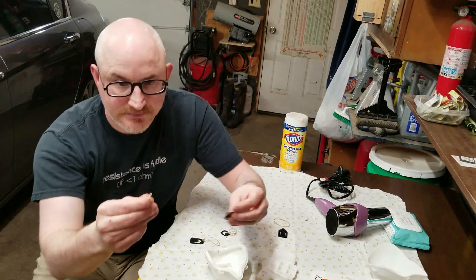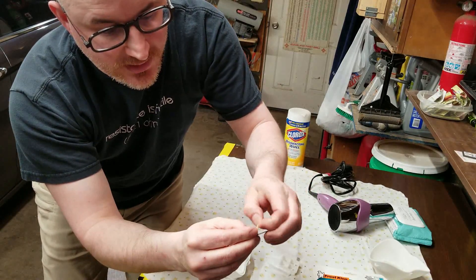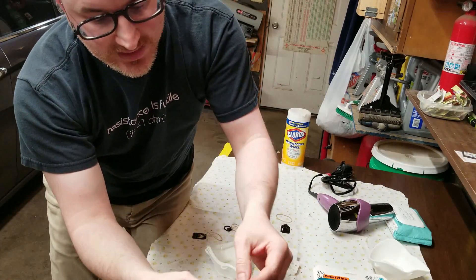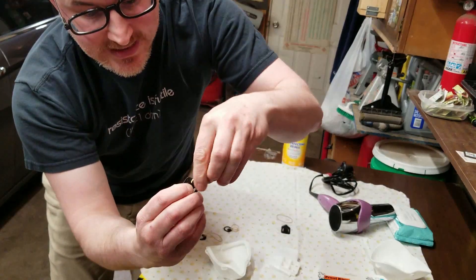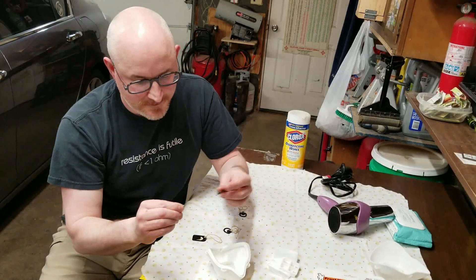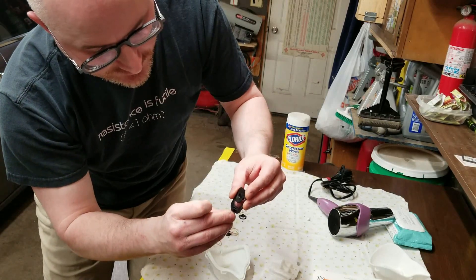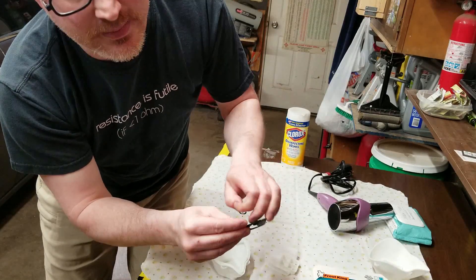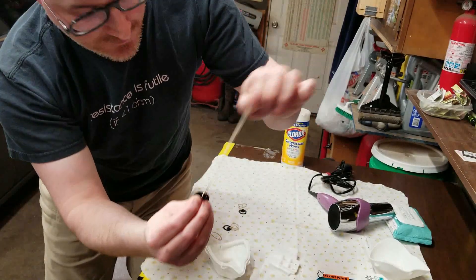So you take your rubber band, you pinch it, and you simply push it through. What I'm doing here is feeding it around and through itself. When you pull it, it creates a nice tight knot that is completely undoable. We're going to do that to the other side. I enlarged the holes on these to accommodate rubber bands or string or elastic, but trying to push a rubber band through is like trying to push a boat with a rope — easier said than done. Over and around and through, tighten it up.